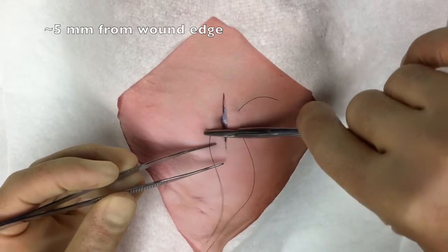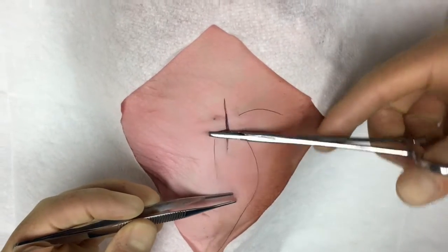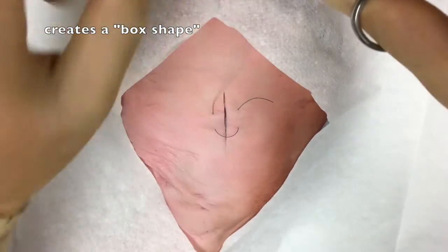The second throw occurs in a backhanded fashion, is driven deep within the tissue, and exits again on the same side of the wound parallel to the wound edge, such that a box shape is created.